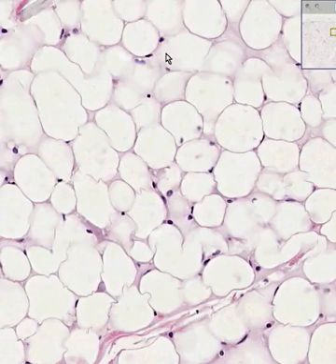So that's probably an adipocyte nucleus. That probably is. That could very well be. Perhaps that's a lymphocyte. Perhaps that's another round cell like a lymphocyte or a macrophage. You really can't tell just from an H&E stain.